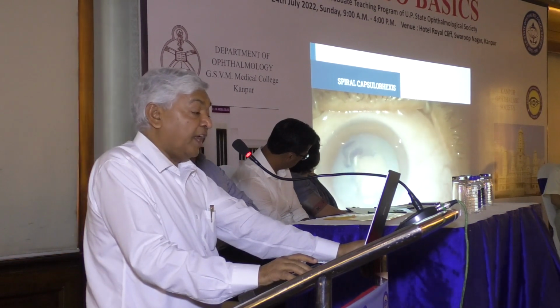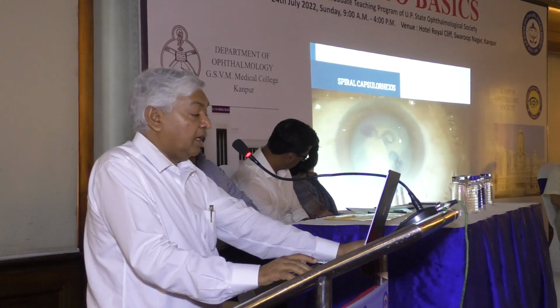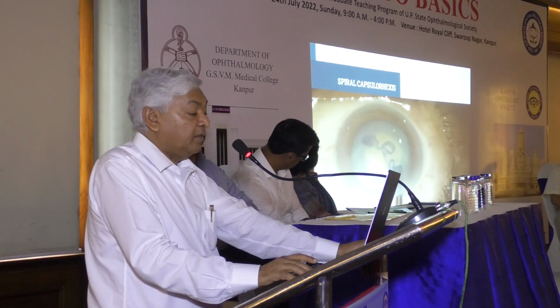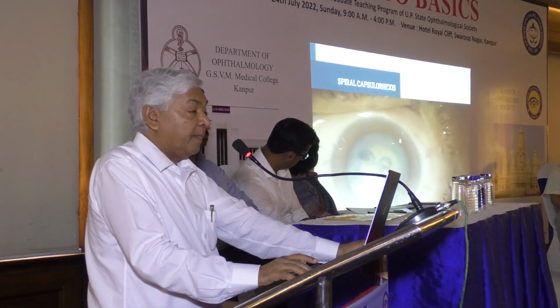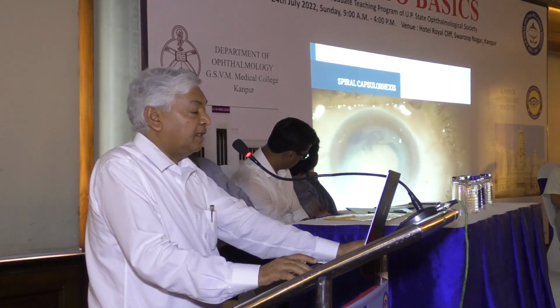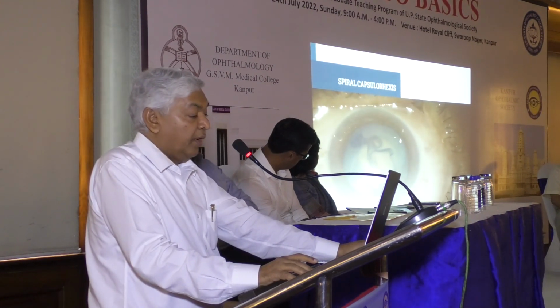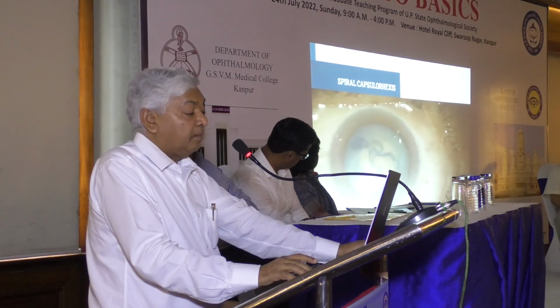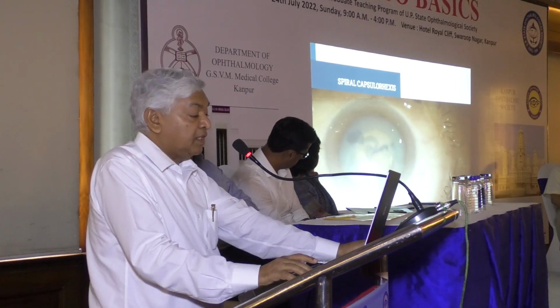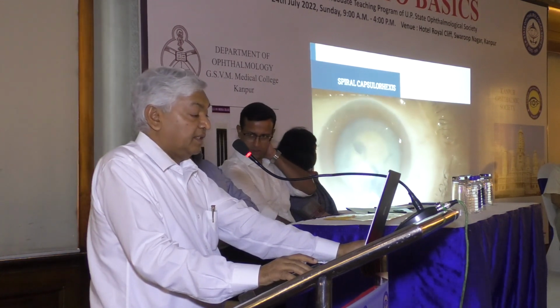It should always be flat, mind it. If it is floating in the anterior chamber, it will extend in any direction. So gradually make it with steady movement in the right direction. Gradually flatten it over the anterior capsule, and repeatedly inject the viscoelastic substance. The chamber should not be shallow in such conditions once you are going to make it. You can make it 5.5 to 6 mm, or sometimes make a small rhexis and do a secondary extension of the rhexis later on, after the implant.